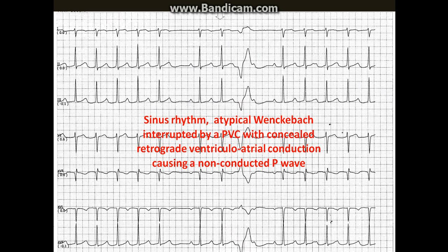So this case is atypical Wenckebach interrupted by a PVC with concealed retrograde ventriculo-atrial conduction causing an unconducted P wave. I hope you liked the case.